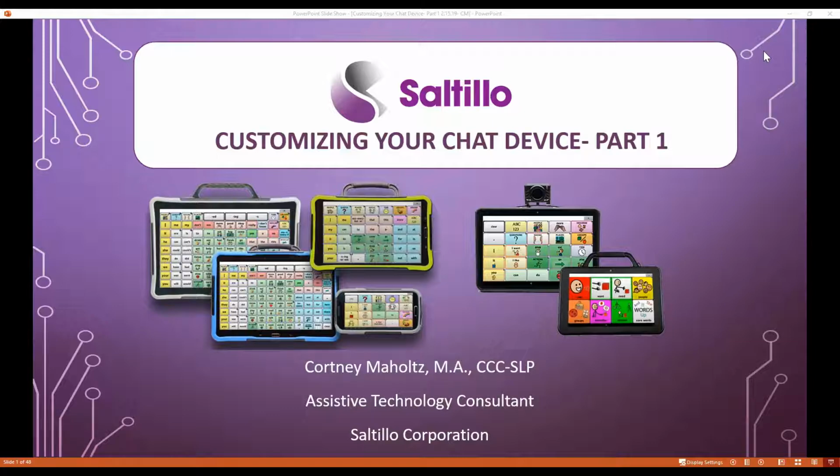And I hope to use all of that experience and bring that to the training today to give you some really good tips and information on how to customize your device so that it will be successful for your users. So let's go ahead and get started.